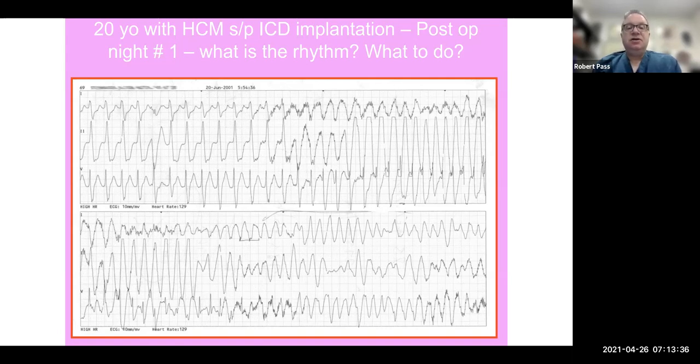And during the induction, VT was induced, and the patient's device detected the VT and sensed it and shocked the patient out.